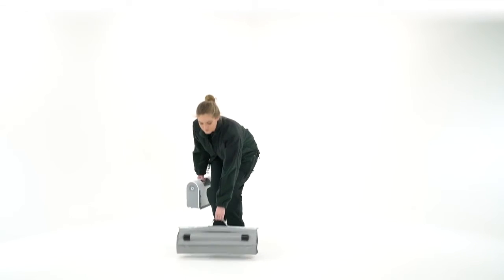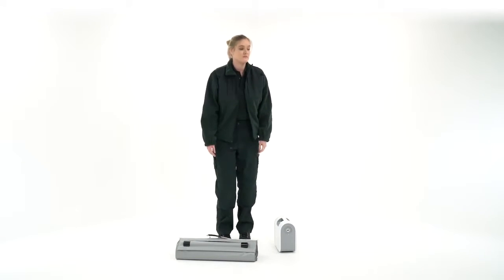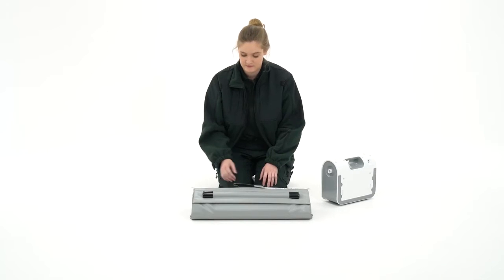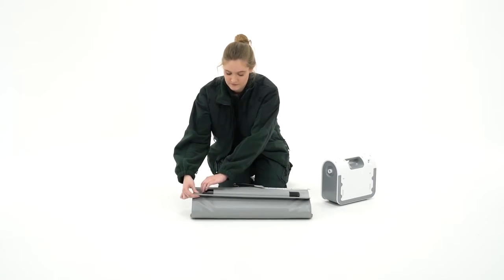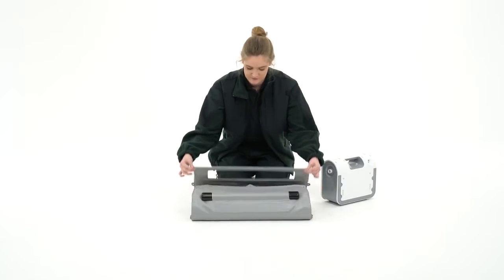The Elk is compact, lightweight, and portable. It's easy to unpack and set up either inside or outdoors. The Elk is powered by a small, lightweight battery compressor called the Airflow 24.